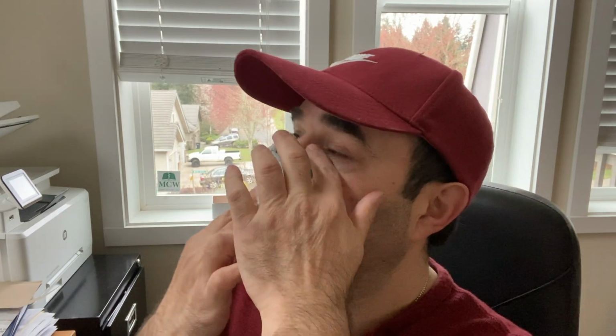All right. And then again, the final fit is you're going to want to hold it against your face. You should be able to just use one finger to hold it and then test that there's no gaps. Shouldn't be any gaps all the way around. And remember, once this is in the mask, it's going to push it against your face with the nose piece. You'll have a perfect fit.